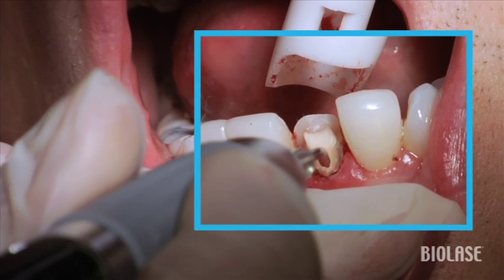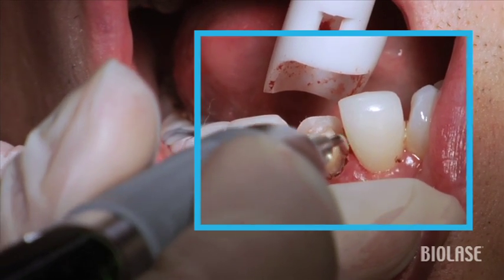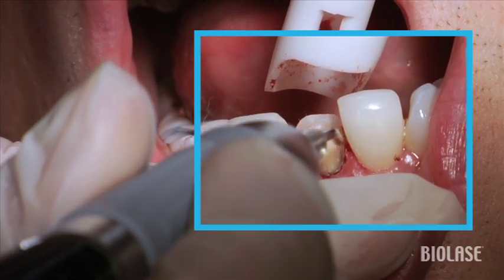Here we can see that we're getting a very nice hemostasis as well.